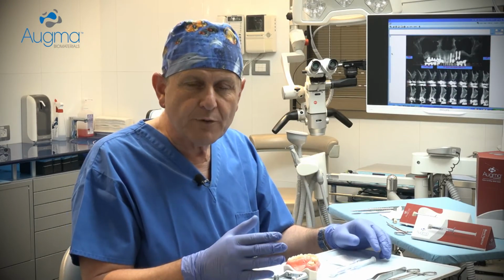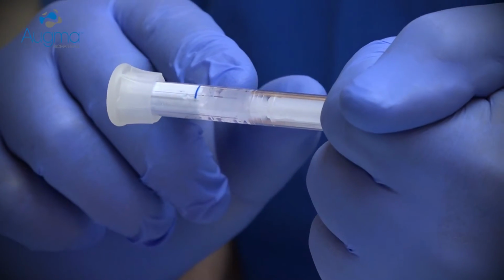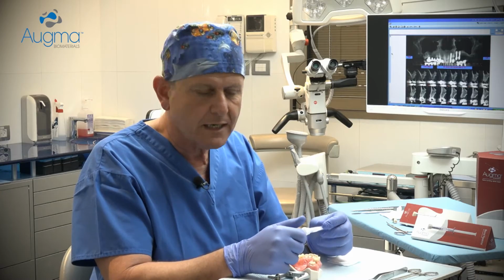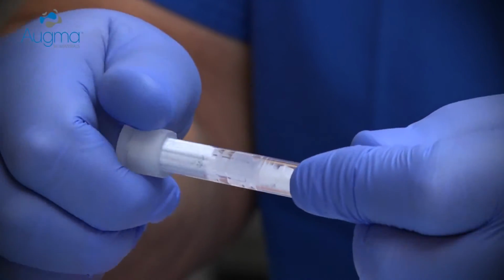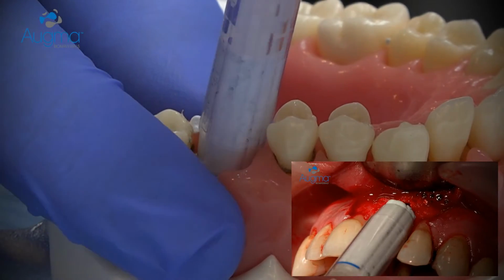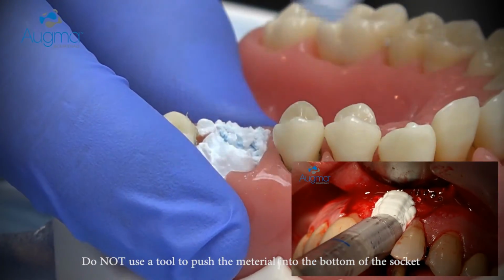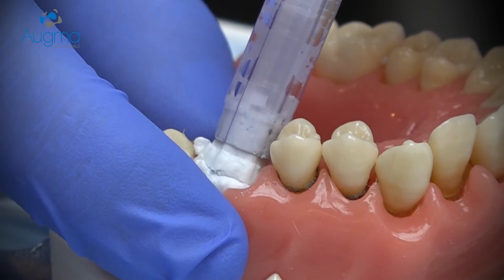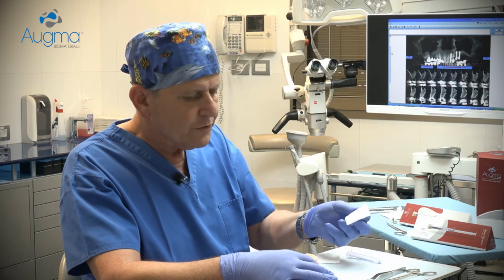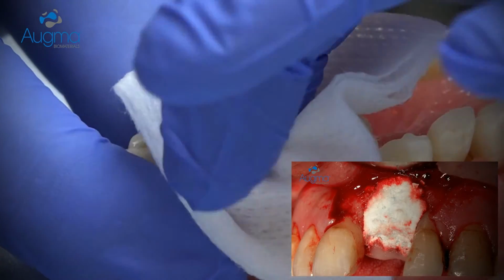Now, I would like to demonstrate how to work with Bond Apatite for socket preservation technique when you don't reflect the flap. Press the shaft against the palm of your hand until the first piston reaches the blue line. Now the material is already activated. Remove the syringe head, approach to the socket site and eject the material into the socket. Slightly overfill it.